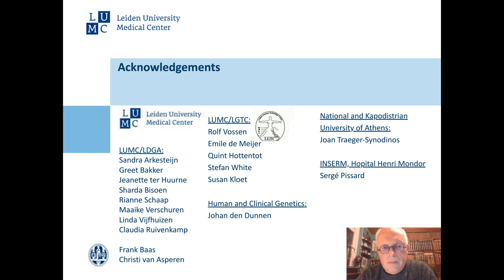From Terence Agbor at Dynalife, a few months ago there was a CAP challenge consisting of high affinity hemoglobins, Heathrow, Malmo, and Olympia, etc. It's difficult to distinguish these variants by HPLC and capillary electrophoresis. Do you happen to know how these variants migrate in gel electrophoresis, acid alkaline? We run our hemoglobinopathies with CE, then reflex to gel electrophoresis.